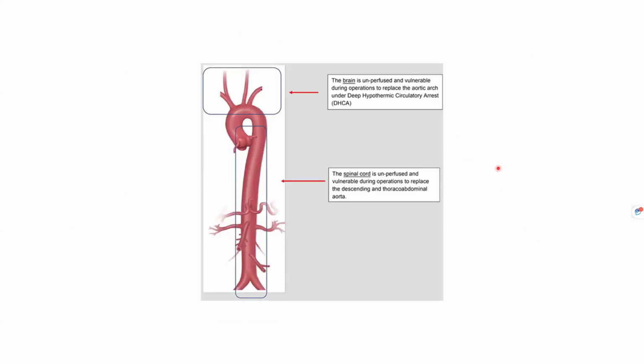Another thing that I read in a few articles, being used in certain centers, is some newer techniques to protect the brain and spinal cord. Further cooling, like using special cooling catheters placed intraventricularly in the brain, called intraventricular brain cooling catheters. And the other is spinal cooling catheters. We don't use it. We don't need to worry about it in STS because we don't code it there. But this is something that is coming, and who knows, it might be added down the lane.